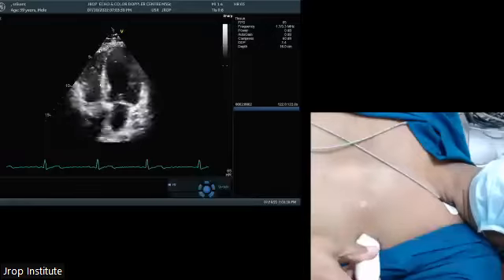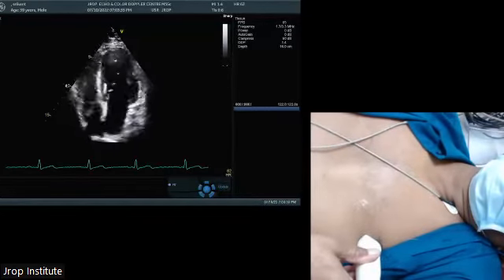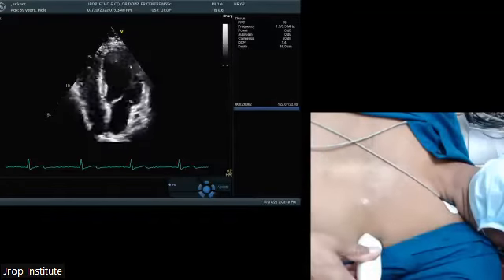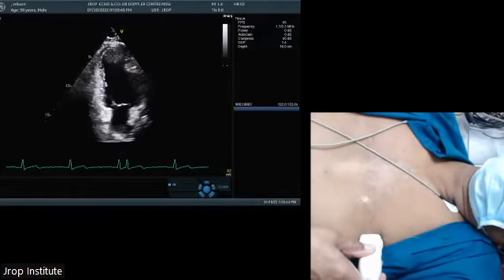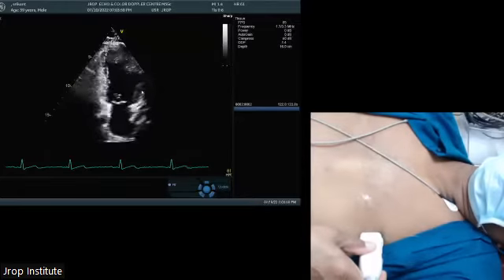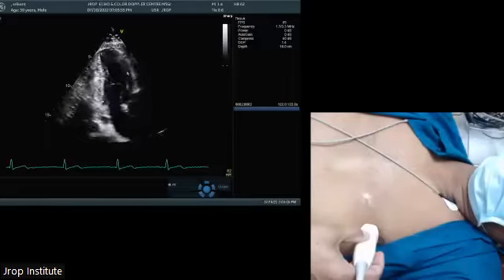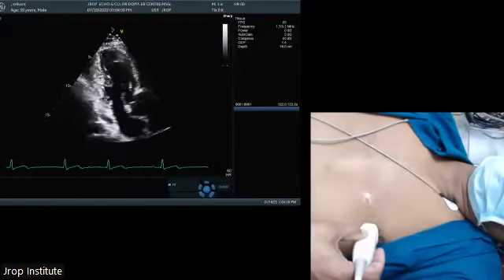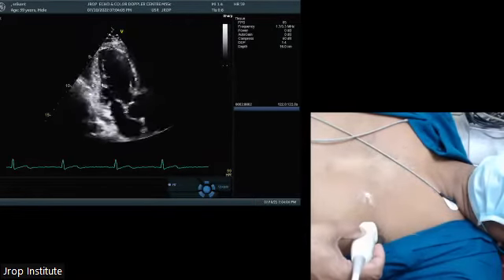So I said the 4-chamber view has the middle basal septum supplied by RCA, apical septum LAD, apical lateral wall LAD, middle basal lateral wall circumflex. Counterclockwise rotation: middle basal inferior wall supplied by RCA, and the whole of the apical inferior segment and the whole of the anterior wall is supplied by LAD. Counterclockwise rotation: mid anterior septum and apical anterior septum, mid anterior and basal anterior septum by LAD, and this is supplied by circumflex. Right?